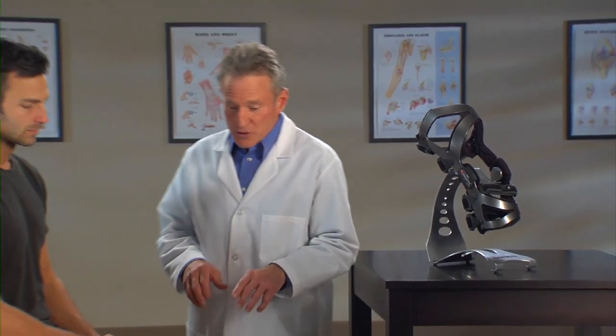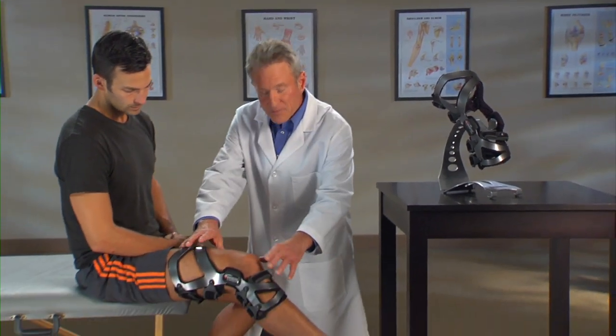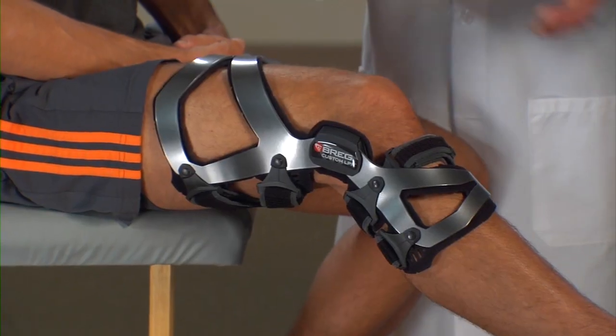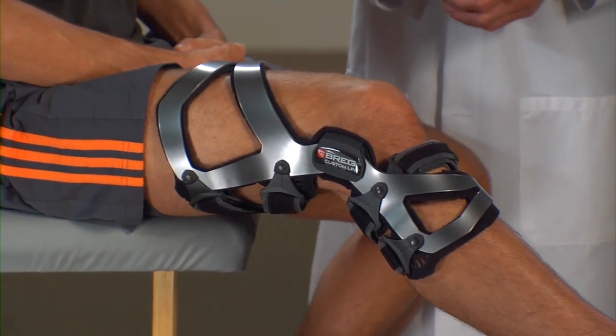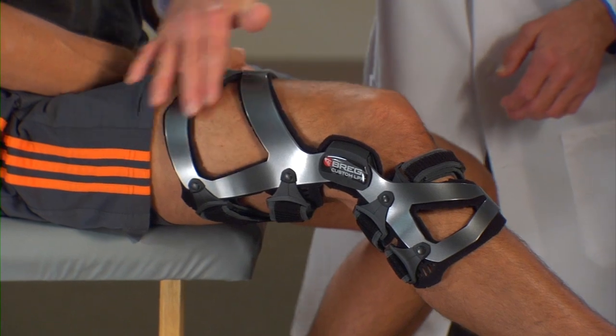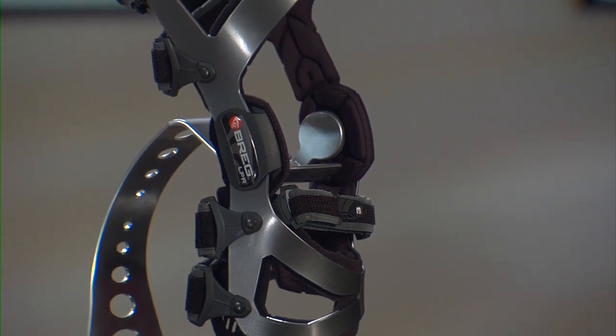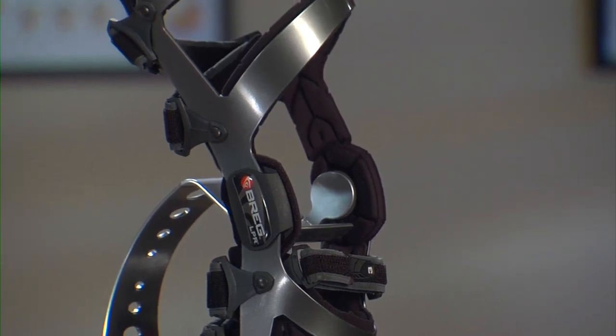Here's why. First, there's the brace frame. You can see how it's contoured to hug the leg — you don't see any gapping or pinching. The brace's truss frame, these angles here, provide structural stiffness and strength. The frame is actually made from aerospace aluminum, making it strong yet lightweight.